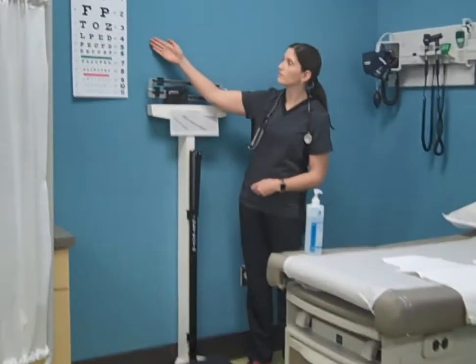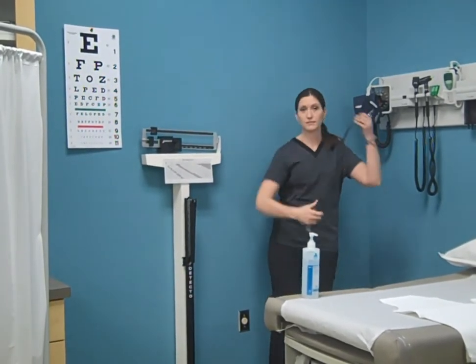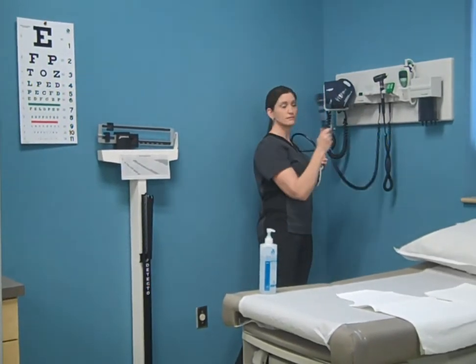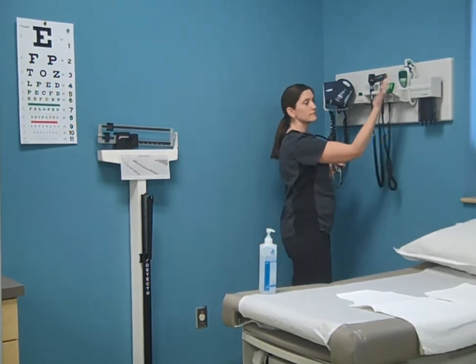For example, a Snellen chart, scale, stethoscope, blood pressure cuff, ophthalmoscope, otoscope, and thermometer.